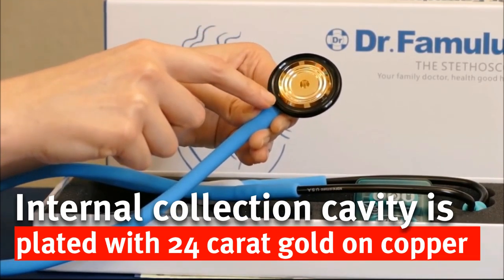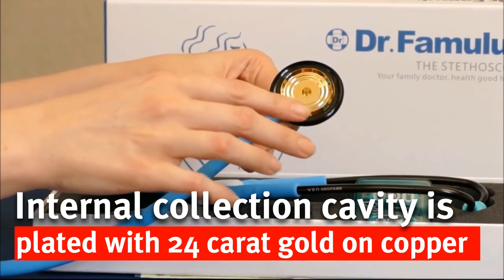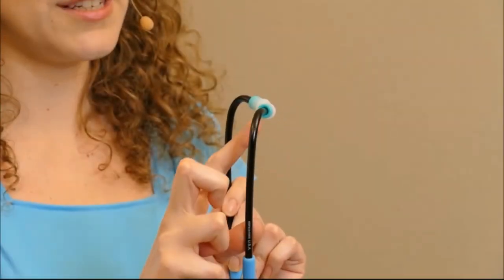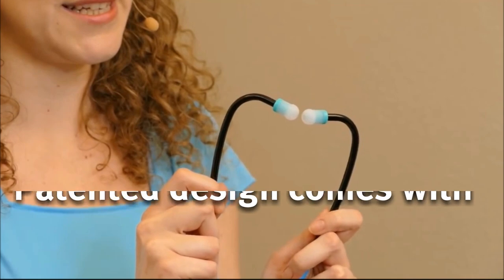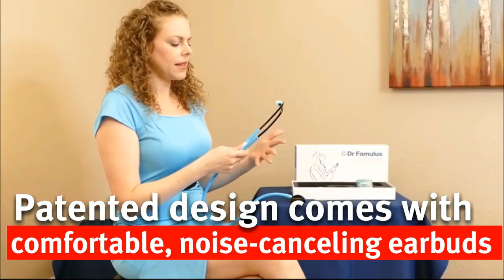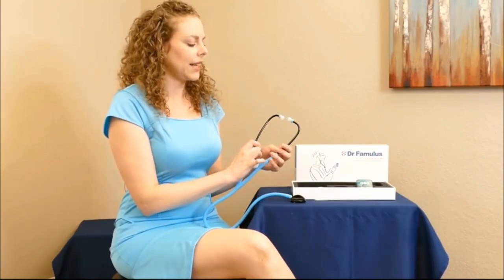The collection cavity in here is actually 24 karat gold-plated copper, and they have patented this design. The contour and design of the little ear pieces, along with interchangeable sizes of the earbud, make this something that will be comfortable for you to wear. I love that they've really taken care to design something that's going to be comfortable and effective.